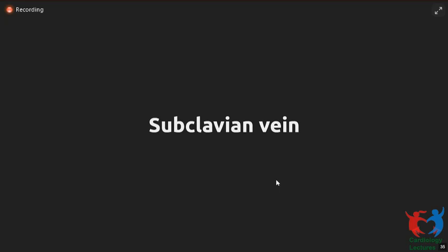So like I said, the last fallback is the subclavian vein. We usually end up using this in the setting where, after multiple attempts, we have not got the axillary vein. Typically in those cases, if you've done an inadvertent axillary artery puncture, or you punctured the axillary vein a couple of times and not been able to pass a lead, the whole vein goes into spasm. If you do a repeat venogram, you see that the whole axillary vein is in spasm and the vein only reforms medial to the first rib. Then you might have to go for a subclavian vein puncture.